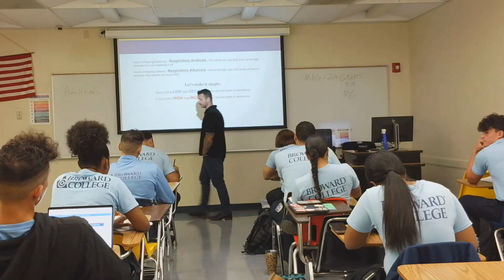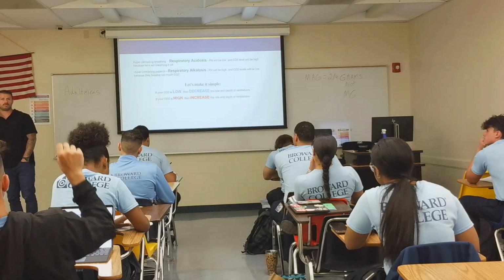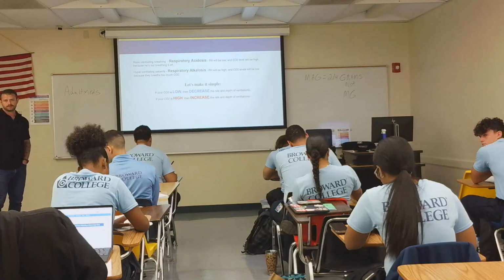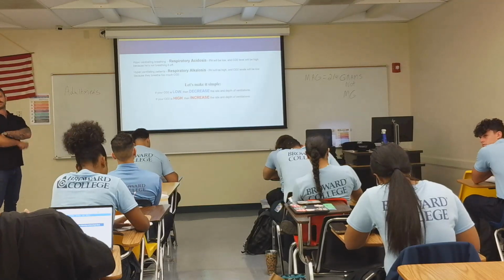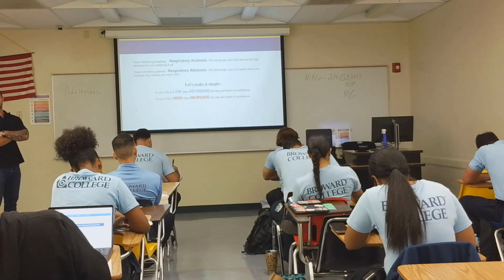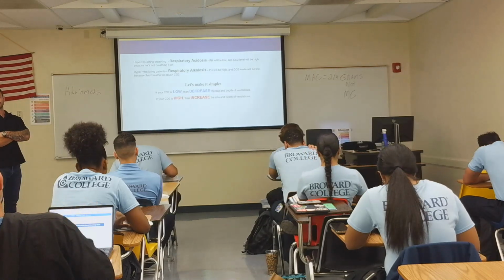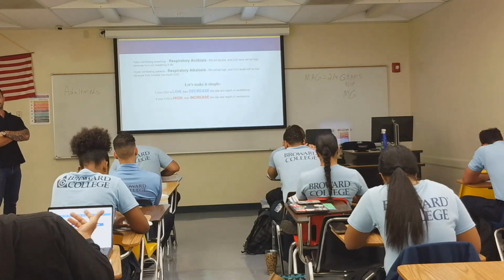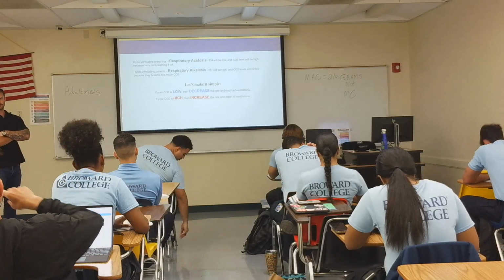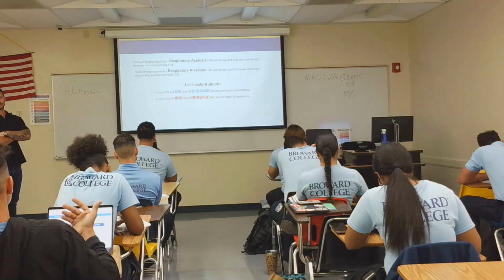Would their SpO2 also be at 100? Oh, it depends. I did a ride once where they were trying to differentiate if it was a chest pain or an anxiety attack. It was a pediatric, so they weren't going to do the 12-lead on her. But one of the firefighters said you can tell she's having a panic attack or anxiety because her SpO2 was at 100 the entire time, it wasn't fluctuating. Sometimes you can tell from that.